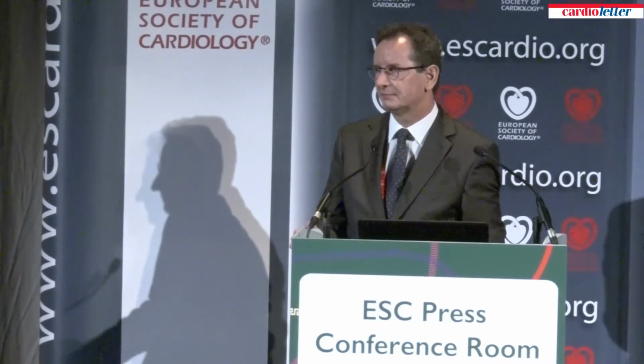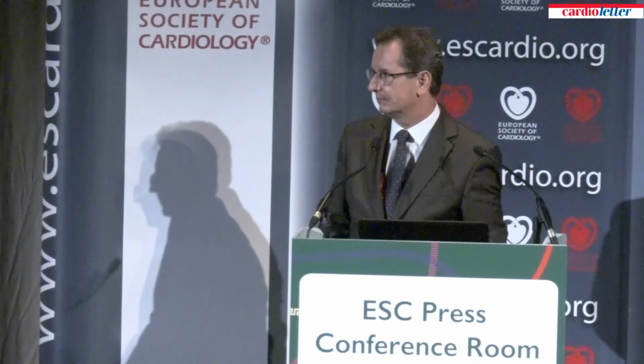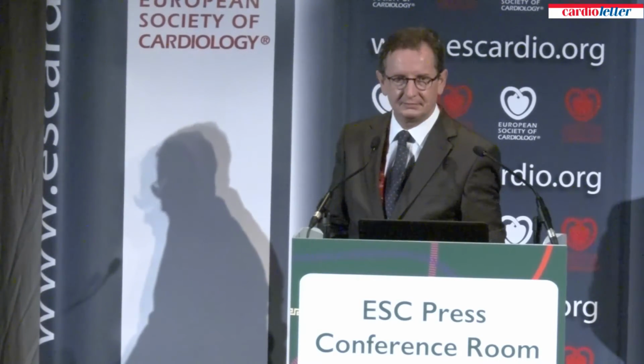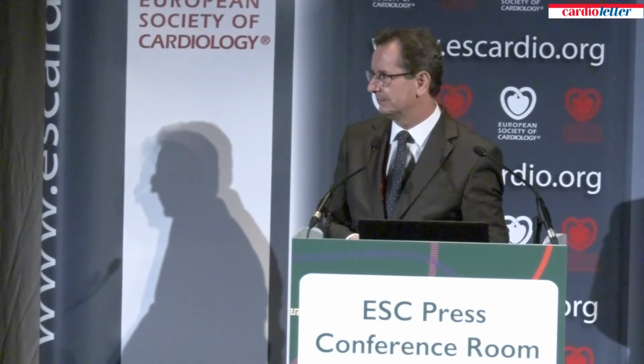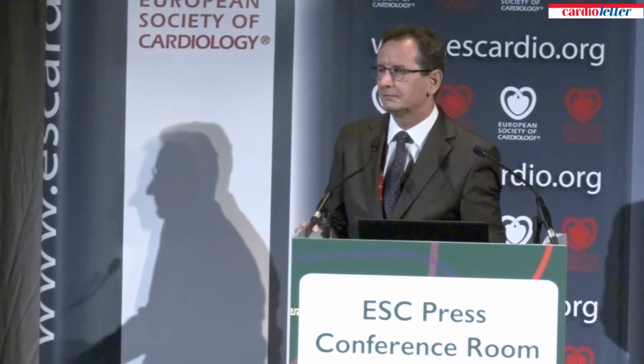The final kiss, for your information, means that you have both wires back in the main branch and in the side branch, and you use 2 balloons and blow them up at the same time so that they are very close together like a kiss. That ensures that all the deformation that happens with going through side branches, blowing up one stent, pulling the other in this direction, those deformations are corrected so that at the end you have 2 tubes and you have the best possible alignment of the stent and the best possible apposition.